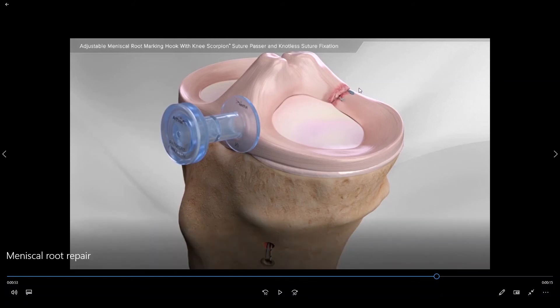This completes the repair of the posterior root of the posterior horn of the medial meniscus. After reattaching the meniscus back down to the floor, it is now re-anchored and able to withstand compression forces across the joint without being pushed out away from between the two bones.